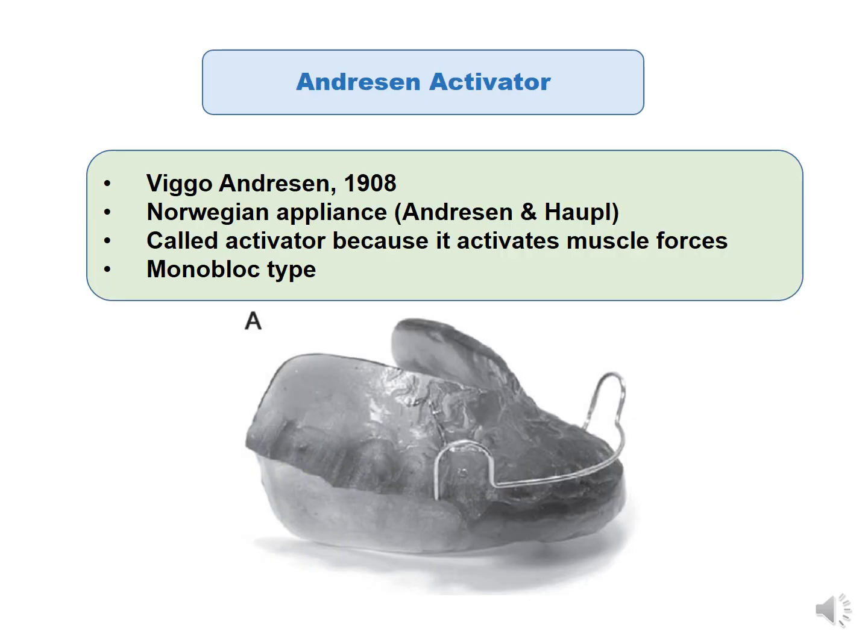Let's have a look at the Andresen activator. This was introduced by Viggo Andresen in 1908, and it later became known as the Norwegian appliance. It is called an activator because it activates muscle forces. Now, the activator is a monoblock type of appliance.